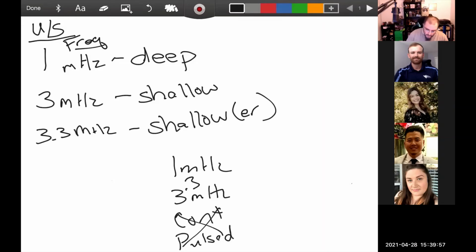Yes. Cool. Is there certain parts of the hand, or I know you mentioned if they have bigger hands or feet, where we would use 1, for example, maybe the calcaneus? Yeah, the main reason I've used 1 before is doing phonophoresis, where I'm driving medication in. Then I have used it, especially on the calcaneus or down in the plantar fascia of the foot, but the only problem that happens is you have to use a lower pulse setting then, because those sound waves going in and hitting off those little itsy bitsy bones of the hands and feet, sometimes, like I said, can cause it to feel really weird. And patients don't like it.